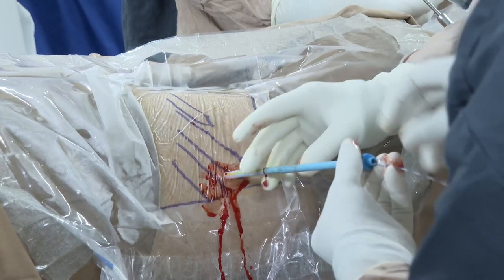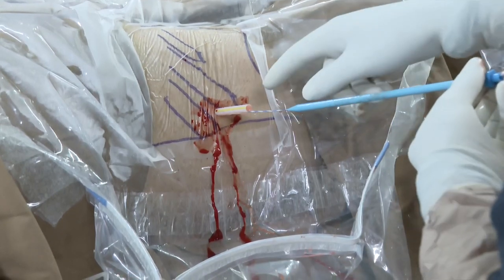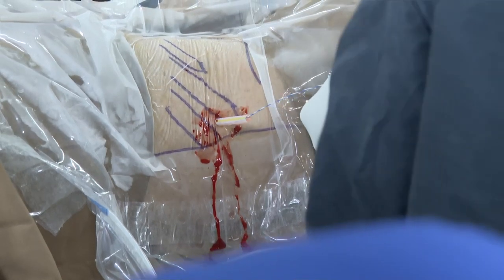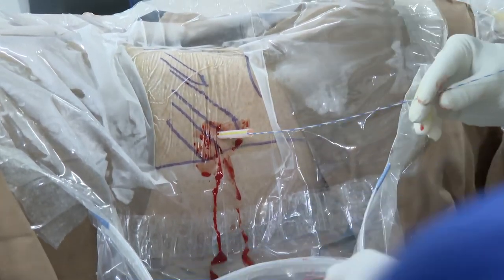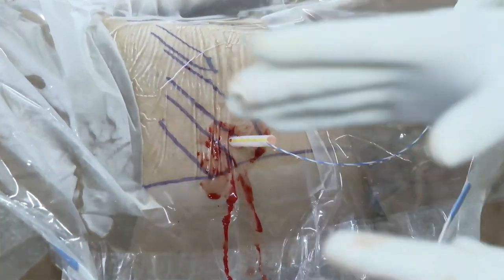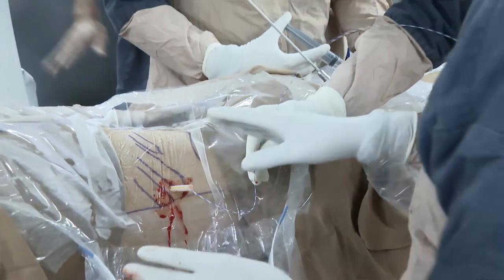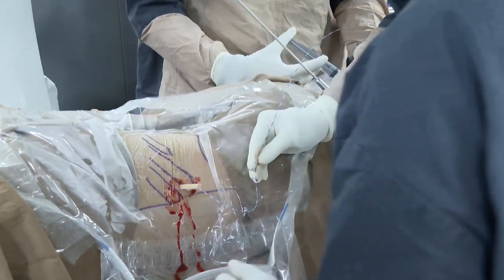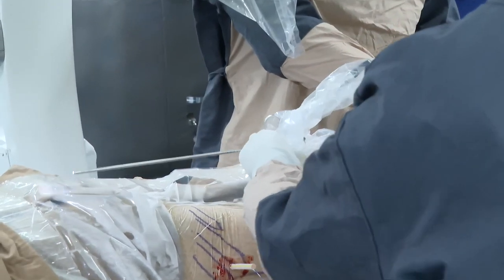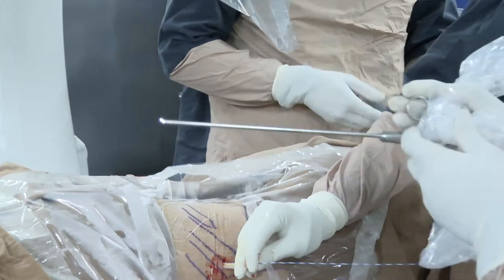Here is the next important tip in mini PCNL: if you achieve an angle less than 45 or 30 degrees, you do not need any separate irrigation pump — the angle acts as a natural irrigation and suction. Clear urine is coming out, no blood at all. Here I have the digital 12 French mini nephroscope and I am going to use it.